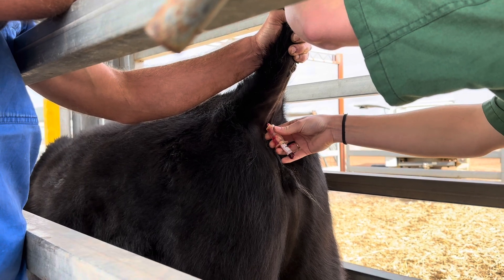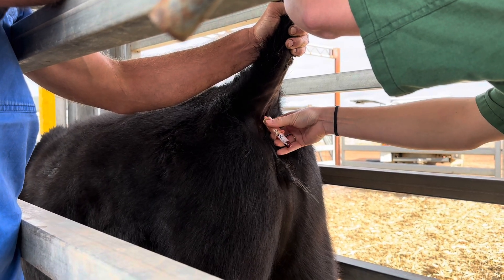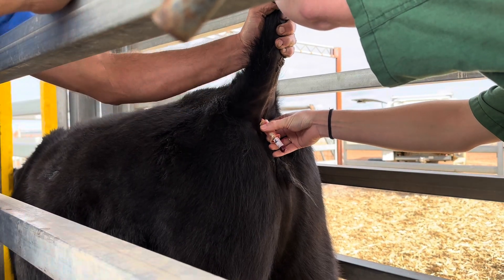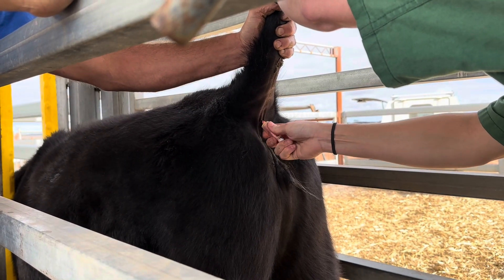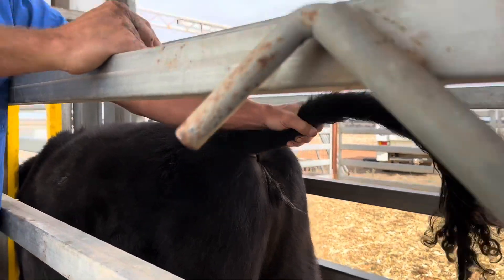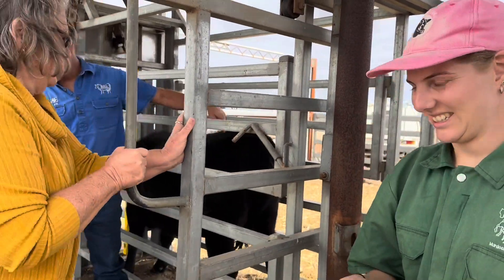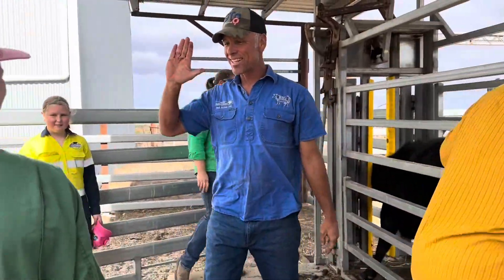Legends! You must be a vampire or something — Transylvania, Geraldton. That's it. And then just pull it out — straight into the vein. Woo-hoo! How cool is that? You want to do one? No. Alright, you're right. High five! That's nice.